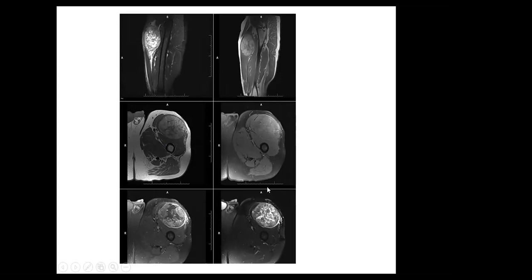And again, when we take cases, we also make a recommendation for further management. The recommendation for this patient is referral to a sarcoma surgeon, and also image-guided biopsy after consultation with a sarcoma surgeon. Okay, so that was that. Let's check responses.